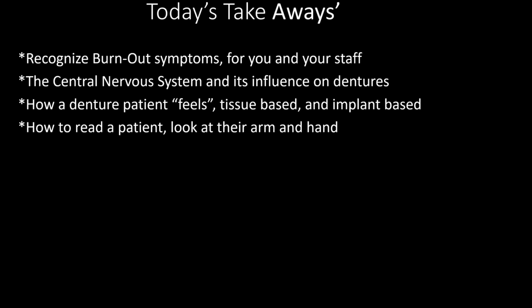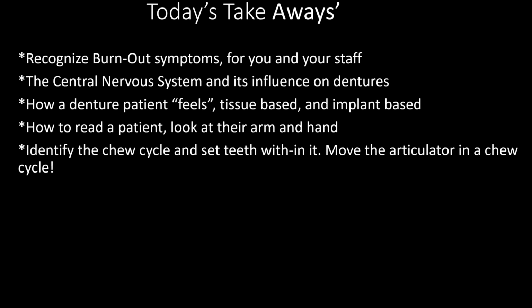That's my point with the central nervous system. It uses sensories to understand things. And then when we come in there as practitioners and change it, we're changing the central nervous system's understanding and its perceptions of the denture. Look at a denture patient, how to read them and gain information from them, because that's going to tell you how to do it and how much more freedom they need.